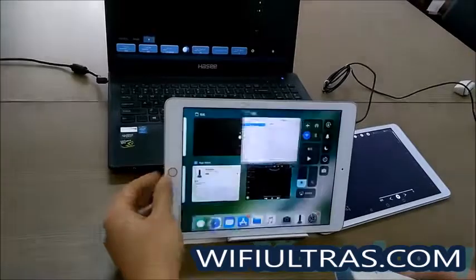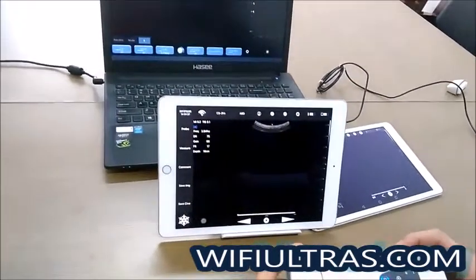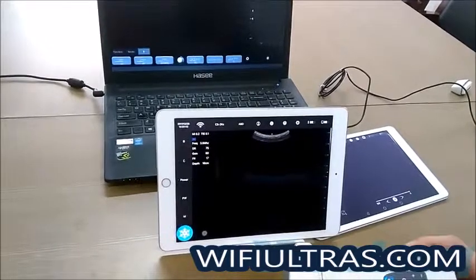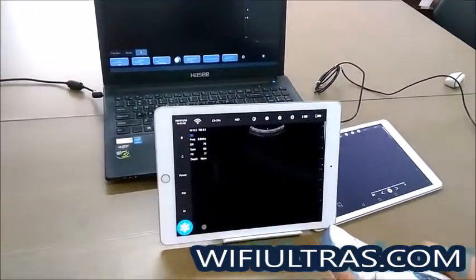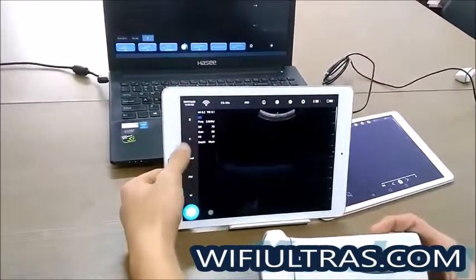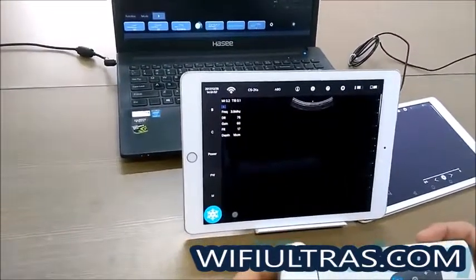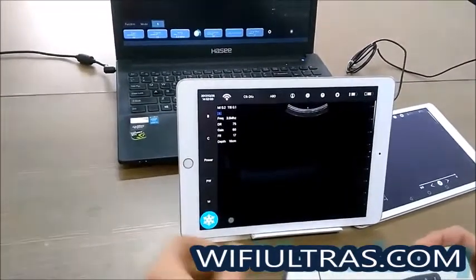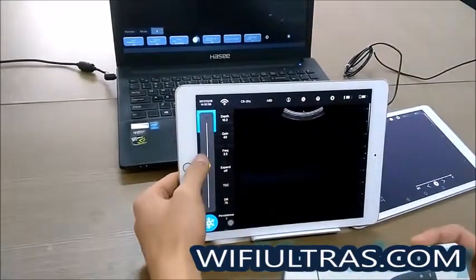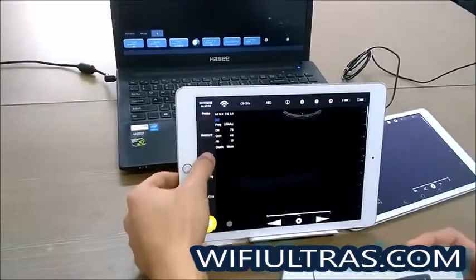Then go back to the software. It's ready to scan. The iOS software is similar to the Android software, so it's nearly the same — adjust, freeze, save image, save cinema.